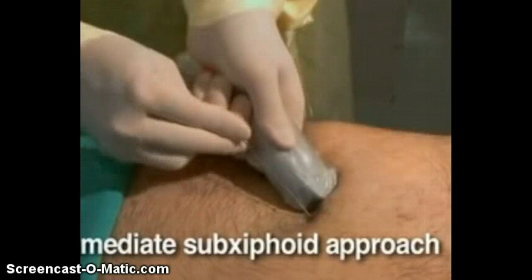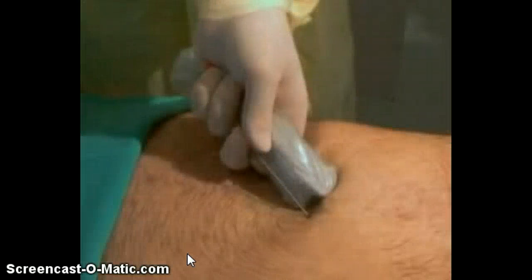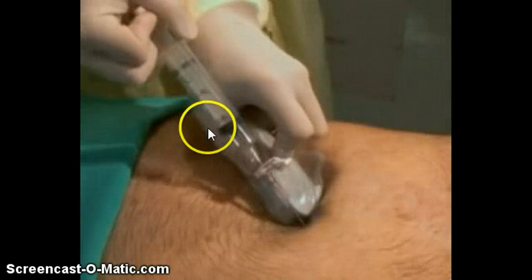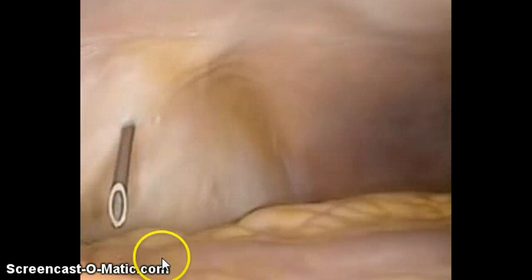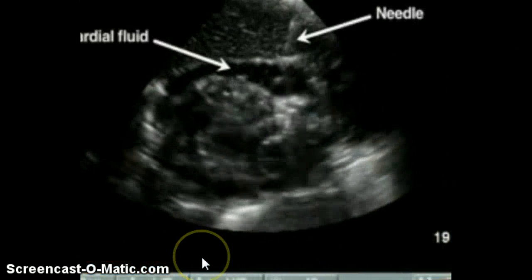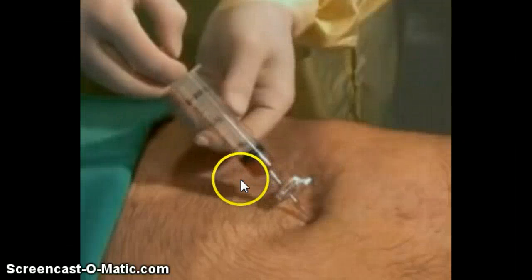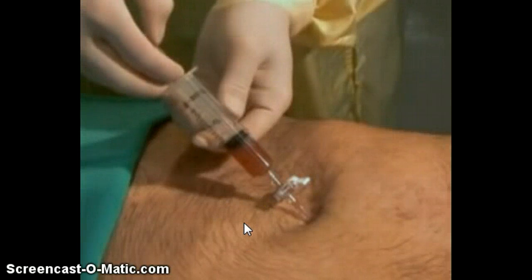The video shows the needle going in — the skin has been cleaned and prepped. Once the needle is in place, a syringe is attached and they start pulling back. This is an internal view showing the heart, where they puncture through the thorax. That's where they're pulling back, or aspirating, removing the fluid that's built up in the pericardial sac — and that is a pericardiocentesis.